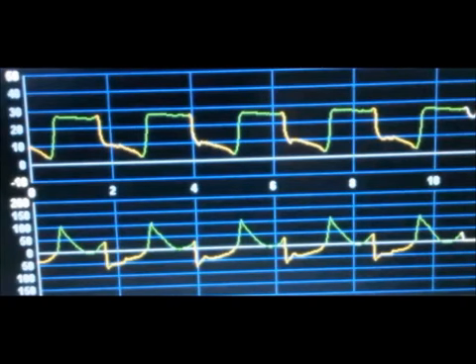Now, what happens if you're using pressure control ventilation and the patient has a high, vigorous inspiratory demand, their minute ventilation changes? Well, in this picture, this is an example. This is a screenshot taken from a patient in septic shock. Now, this is pressure control ventilation. As you notice, the top portion of the screen is my pressure waveform. I have a nice square waveform here.